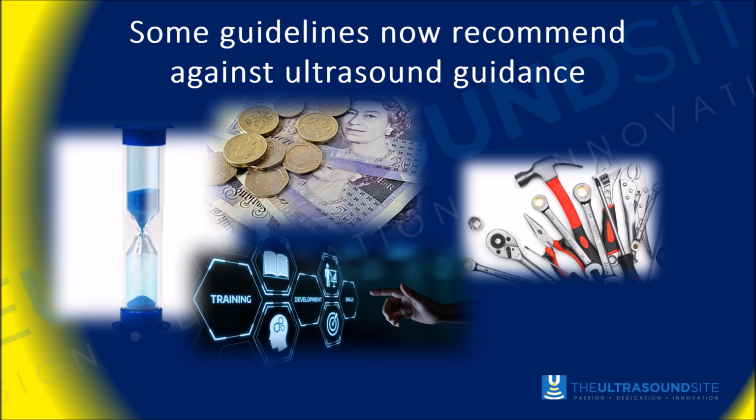And again, because we're looking at a limited resource, so limited time, limited budgets, the costs of training, the length of time of training, all of these things make access to ultrasound guided injections significantly more difficult and potentially more costly than surface marked injections.